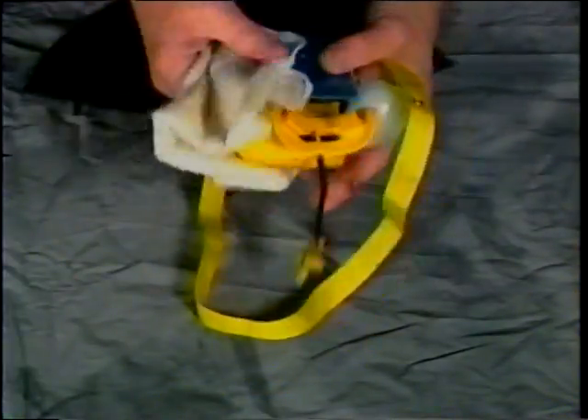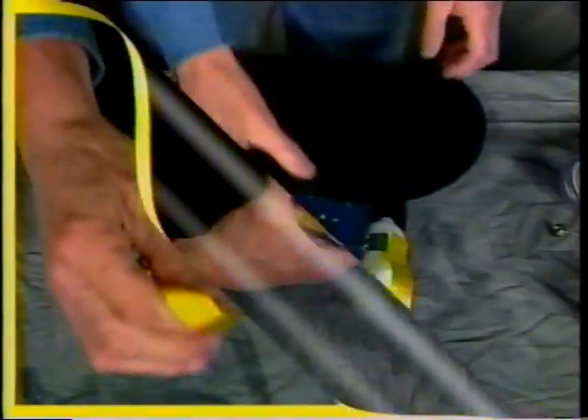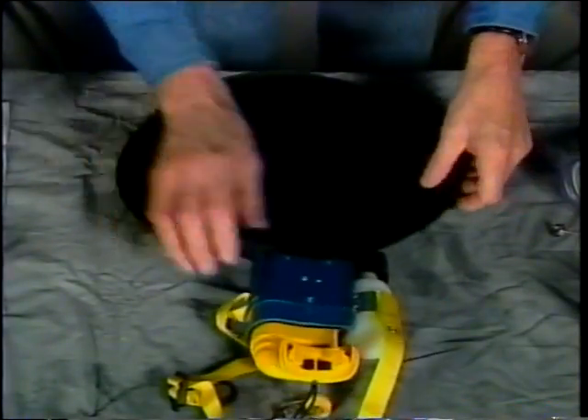Before repacking, assure that the mouthpiece and training unit are fully dry. To repack the training unit, lay the training unit mouthpiece up on the table with the bag flat.